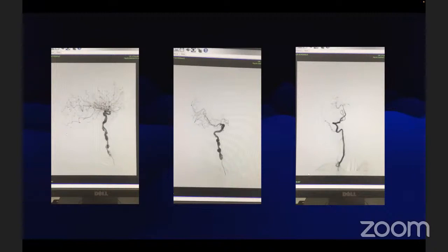So doing a proper angioplasty, that artery may dissect. That is the one thing if you are placing a stent in these arteries. How do we size, sir, in this? Definitely this is a dysplastic one, and in one place it might be oversized, and in another place it might be undersized. So you have to go to the normal artery up and down.